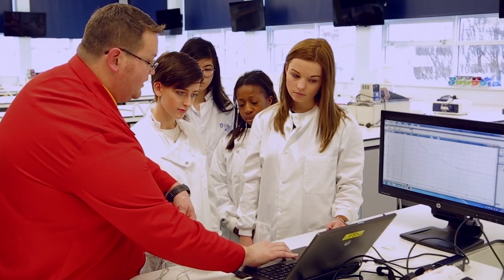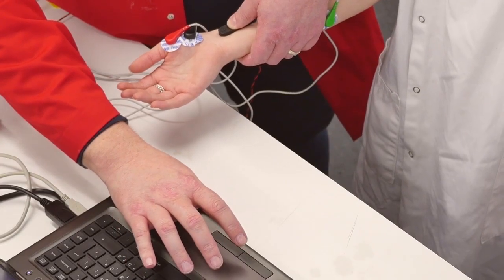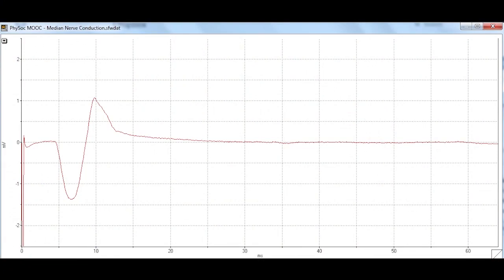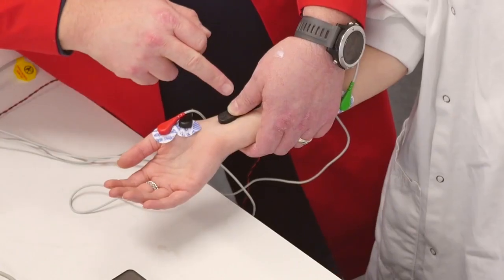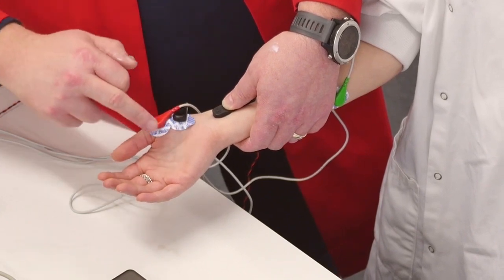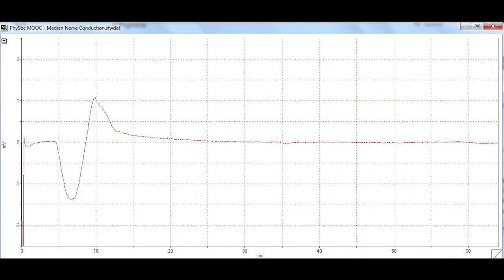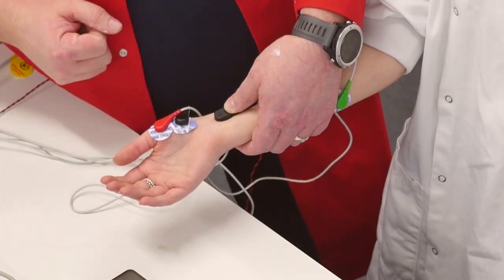We can bring that stimulus down now. There we go — we've managed to get a stimulus which we know is stimulating the nerve, it's causing contraction of the muscle at the base of the thumb, and you can see that on screen as a depolarization and repolarization as the muscle activity moves across the negative and positive electrodes.